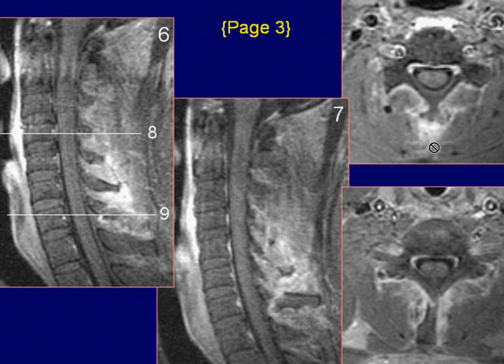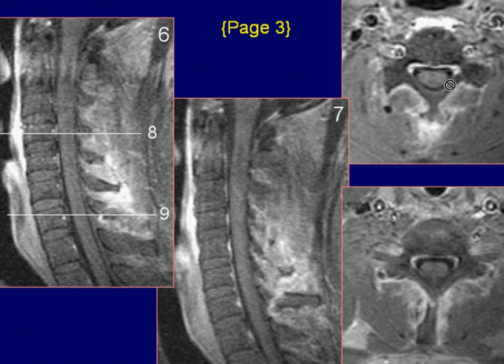Axial post-contrast fat saturation T1-weighted images again show enhancement in the region of the pre-vertebral space and interspinous ligament, with a fracture of the C7 spinous process. There is no significant contrast enhancement seen within the spinal cord.